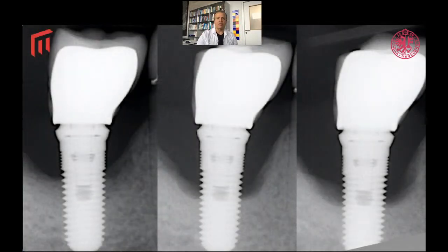And just to illustrate that, I will show you these 3 sequential X-rays from a patient in our clinic, taken 3 to 6 months apart. You will see that if you arrange the X-rays so that the collars of the implants are on the same level, and I know that many of you will react to the marginal fit of the crown, it is correct. It is a very bad marginal fit, or there is no fit at all, but this is not what I want to say.